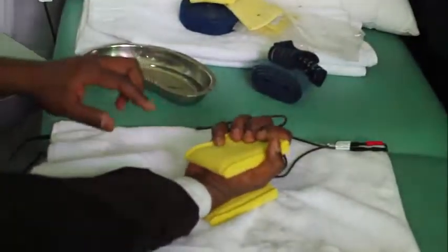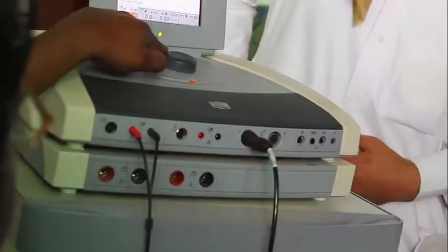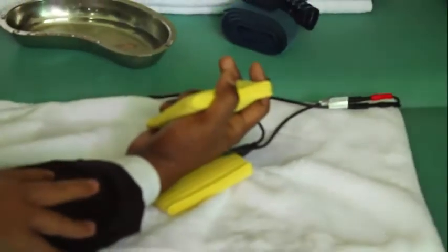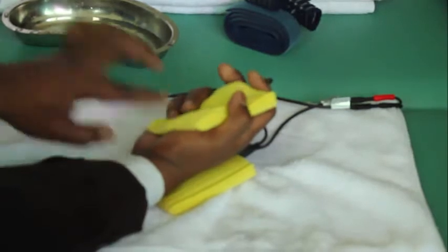So I'm going to stimulate my thenar muscles. Okay? So I'm increasing. Can you see my hand? Pain or no problem? There is electrical current. It's not pain, it's a new stimulus for you. You are going to feel it. Doctor, are you doing that? I am not doing it. It's the current which is doing it. It's done by the machine.